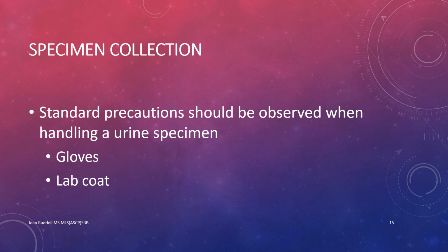Specimen collection. When handling a urine sample, you should observe standard precautions. Gloves and a lab coat must be worn.